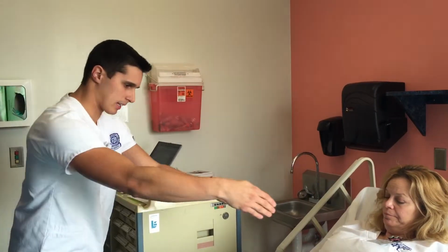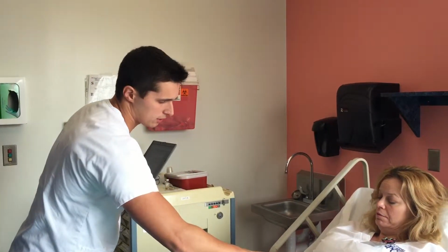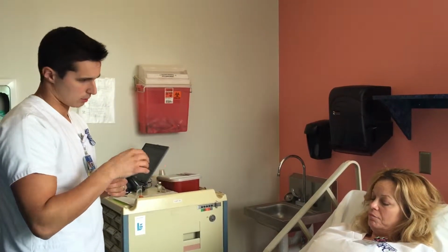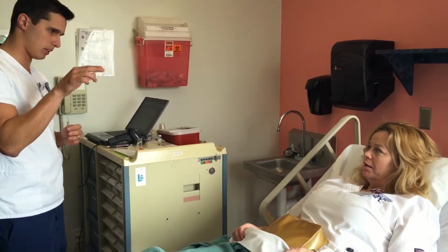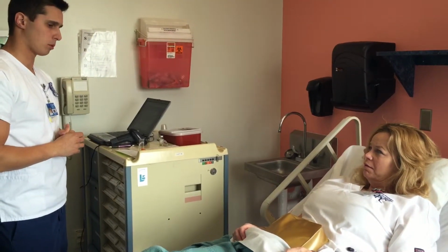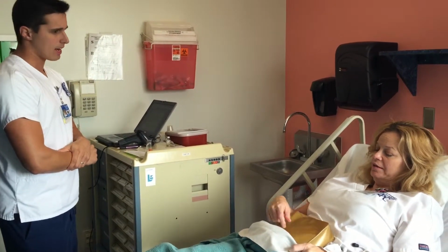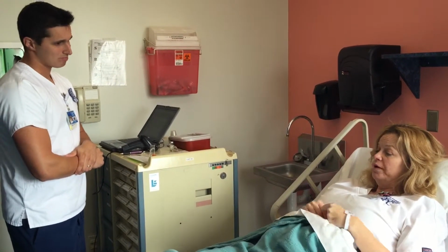For instance, you can make like a grid. You can start here in the morning and move on towards the day and then move on to the next day. Just space them out, staying away from the umbilicus and spreading it throughout the day. So you don't do it in the same spot all the time. Nobody ever told me that. Can you believe nobody's ever told me that all these years?